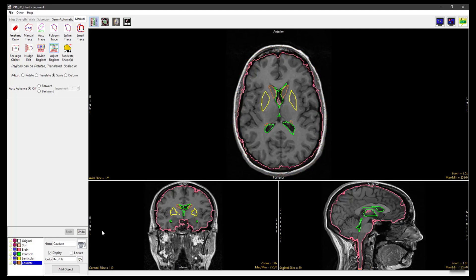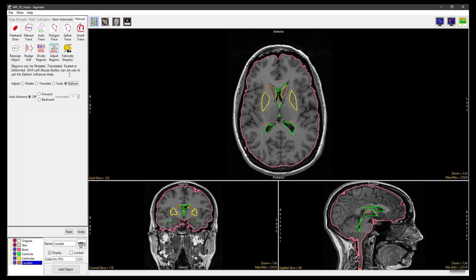Undo the previous manipulations. Now set the Adjust method to Deform. Click in an object and move the mouse to experiment with the deformations available. In this example, we are deforming the border of the brain object. Releasing the mouse button will apply the deformation to the object.